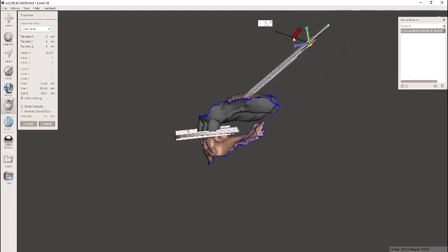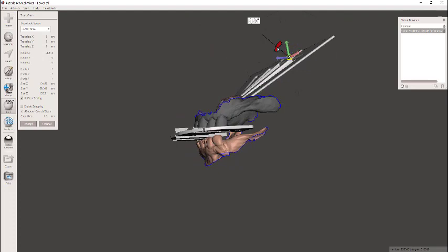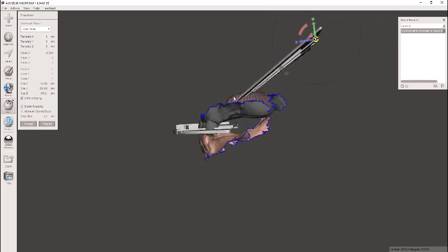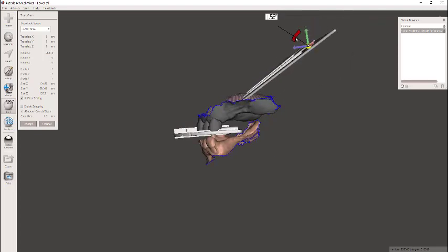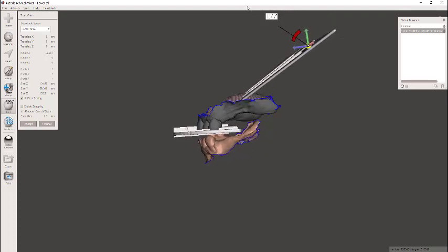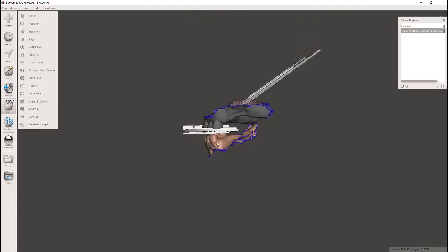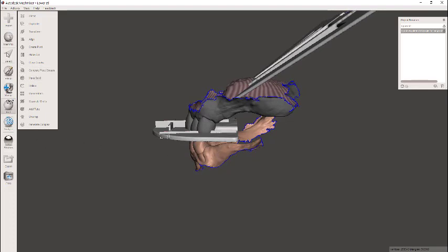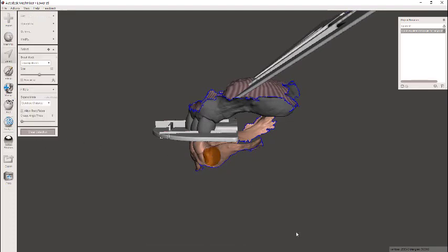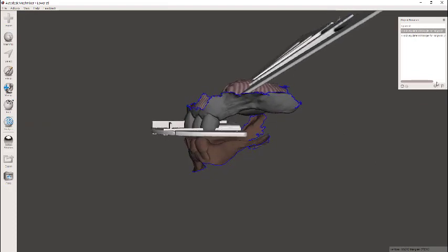So remember, we want to split the difference and go about halfway with it. Somewhere that still looks like it needs to go a bit more. Just a tiny bit more open than that. There we go. That's about where I really want it. And with that closed in now, I can separate back out the mandibular model. So I'll use the select tool, double click just the model, and then while it's selected, go to edit, separate, and now we're back to having independent models.